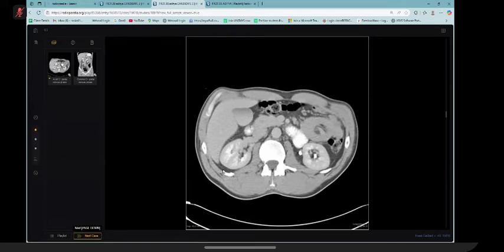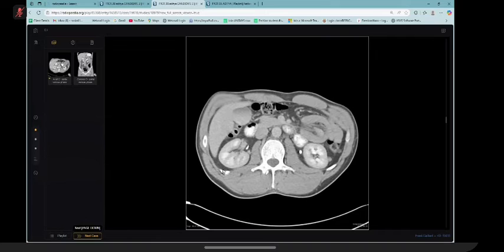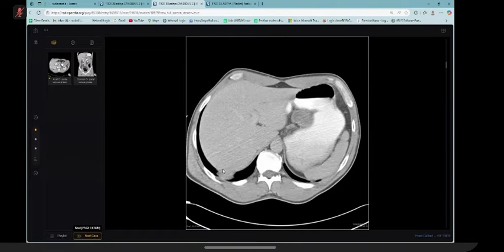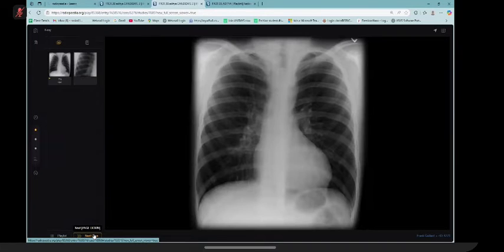Don't worry, because we are not accustomed to this system, that's why it is difficult to pick it up first. Otherwise, UK candidates are trained in such a way that they will speak up this diagnosis first. That's why I have put this case up, and this is a very important case. Mind that. Otherwise, everything was fine. You raised the concern, you said the management, and you also said the staging scan is required. You also said the bone window, which was fine. But just keep this particular scenario in your mind. Okay, and then the next case.